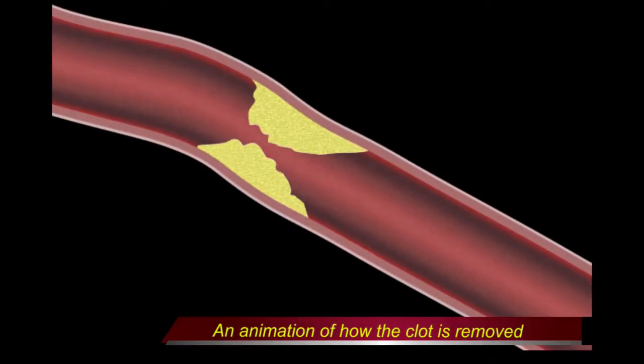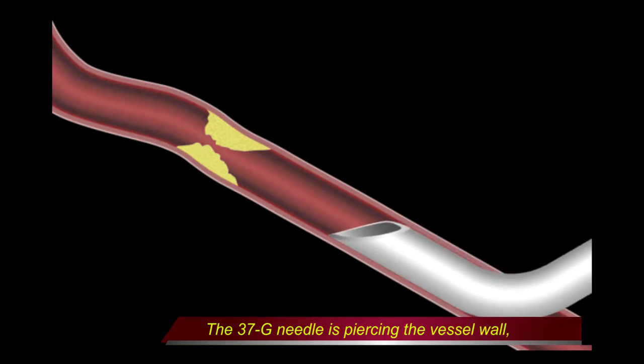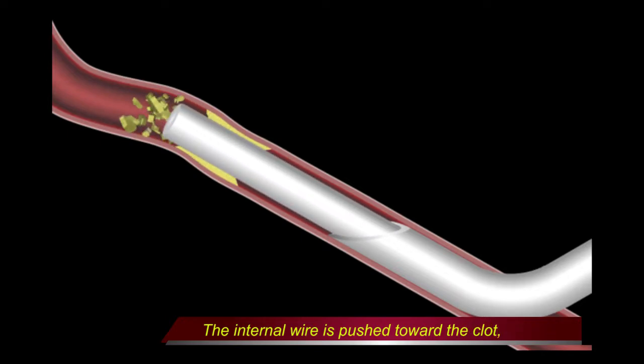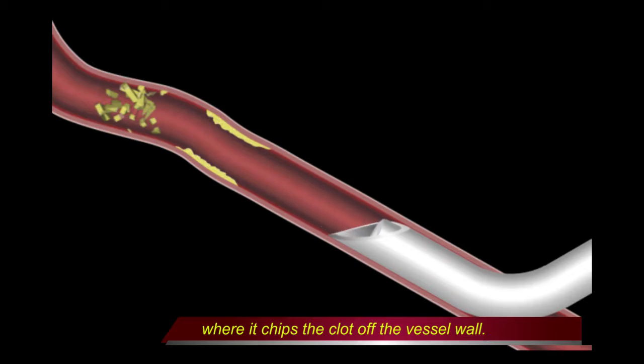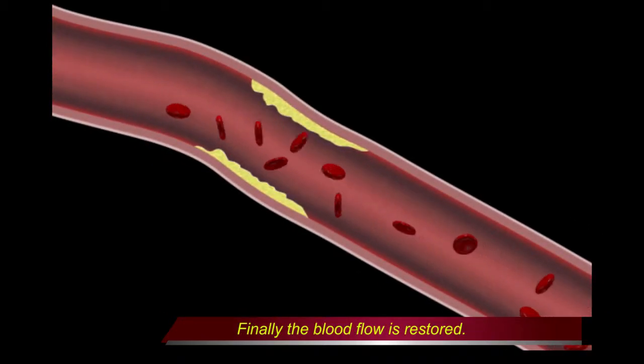This is an animation demonstrating the process of clot removal using this instrument. The 37-gauge needle pierces the vessel wall, making the cutting plane entirely inside the vessel. Then the internal wire is pushed toward the clot, where it chips the clot off the vessel wall. Finally, the blood flow is restored.